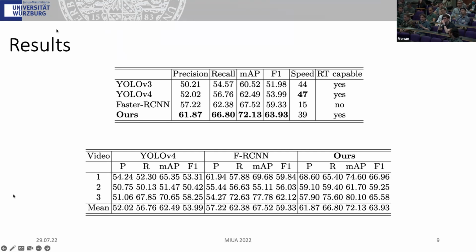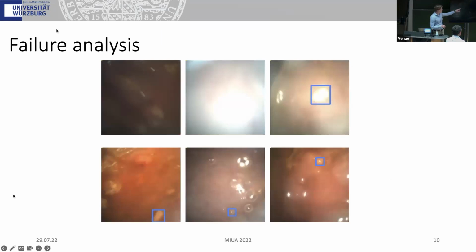Yeah, so the feces and the bubbles. You're right. From a texture perspective, they're actually very different, so it should be kind of easy. But still, sometimes, in those images, I think it's kind of okay. But if you see, for example, the one down there, here you see the bubble, it's a clear bubble. But this one down here, I'm not sure if gastroenterologists could really know that it's not a polyp, and that he didn't have to check and go there to see. So sometimes it's easy, but other times, because of the view and the angle of the camera and so on, it's not that easy. I'm not sure about it, but yeah.